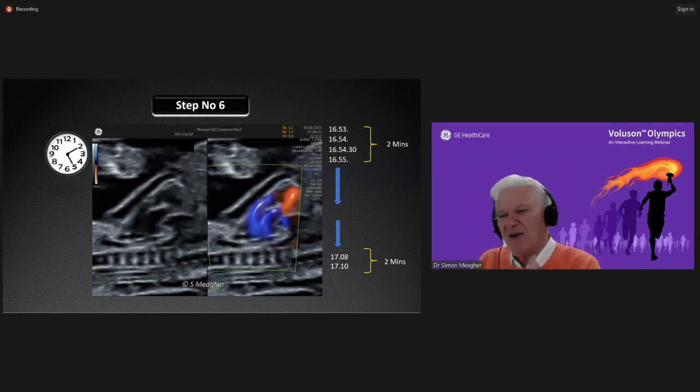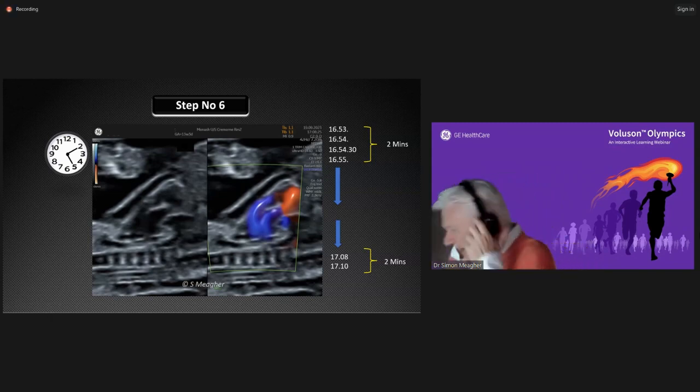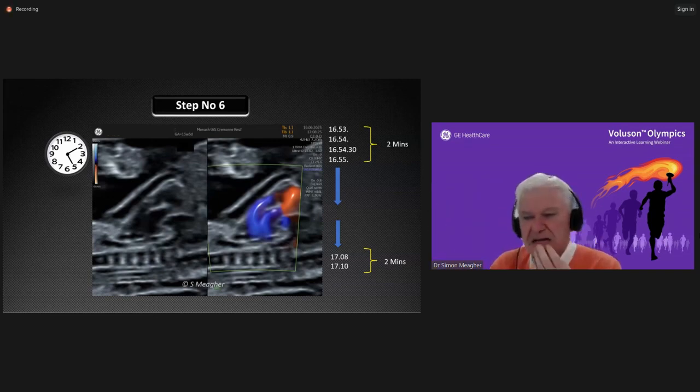The first is the PRF. You set the PRF as number 1, as the priority. And after you've set the PRF, then you go to your power. Once you've gone to your power, you will set, with these newer transducers, around about 95%. And you do not go to 100% in the first trimester with these newer machines. You don't need 100% power. And the third thing you change is the gain. PRF, power, gain, always in that order in imaging the first trimester.